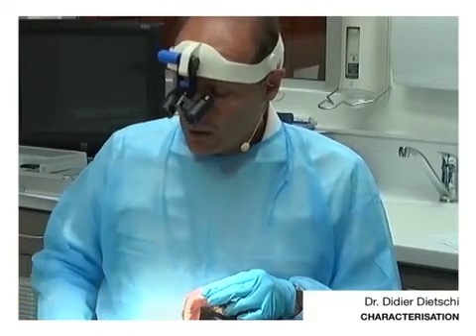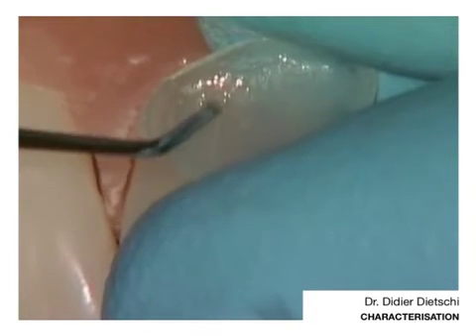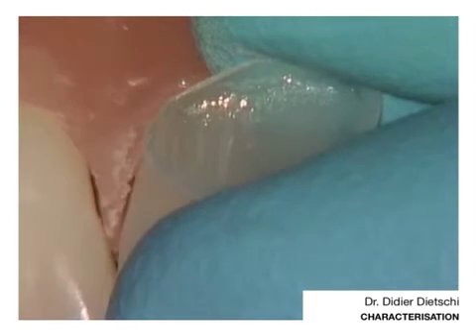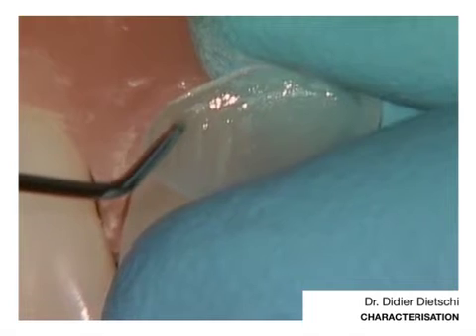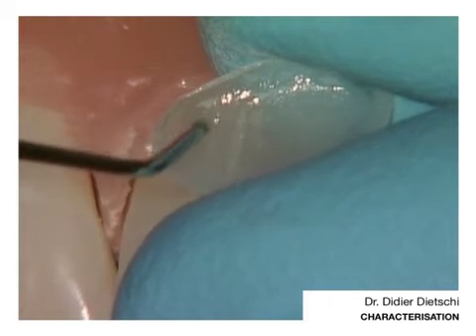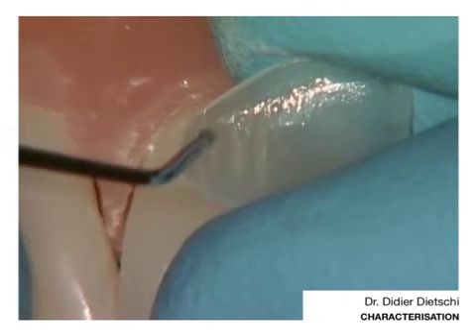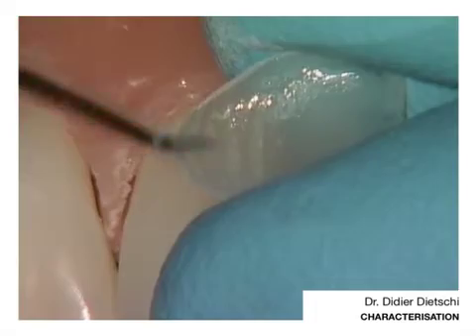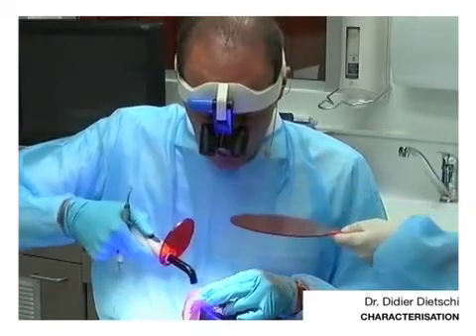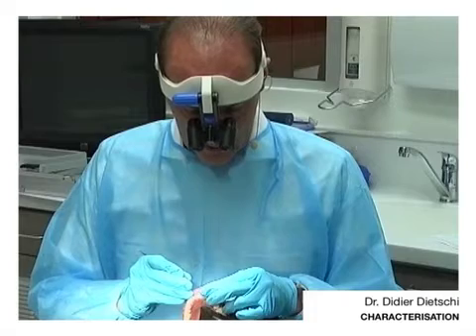I will turn the veneer to take a little bit of white. I am not saying that there is something to do on each case — absolutely not. We can polymerize. And now a little bit of yellow to get a little bit more chroma, but this I will probably reduce a little bit.